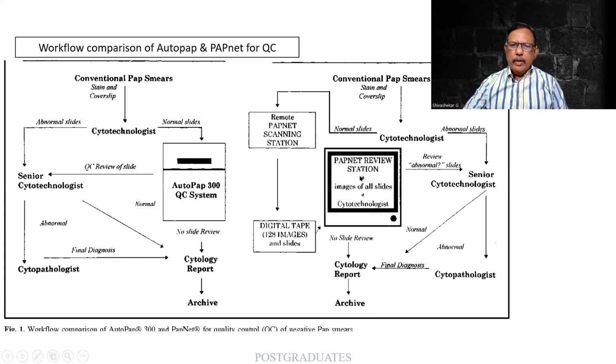Now, what happens is because of this, there can be hundreds and thousands of slides with multiple fields which could be analyzed or picked up accurately. As a result of which, the need for the number of pathologists, it is not the pathologist per se, but the number of pathologists or cytologists comes down.